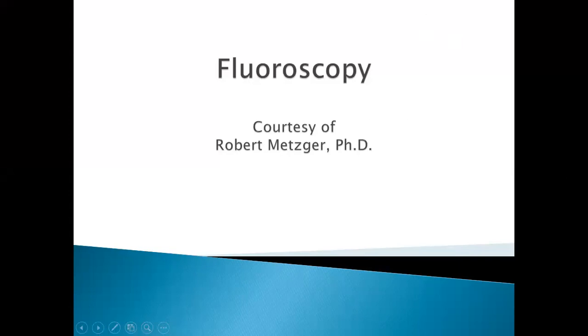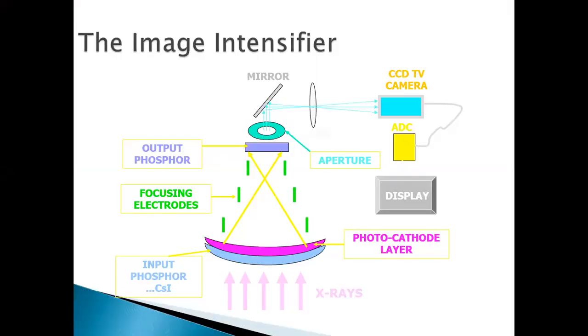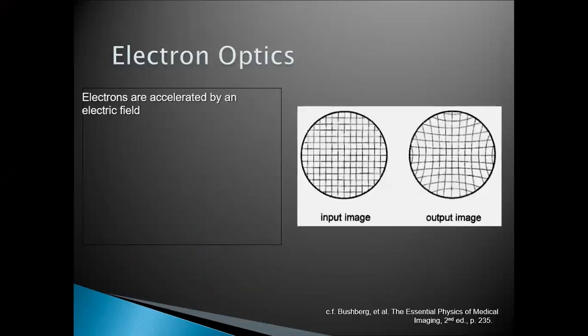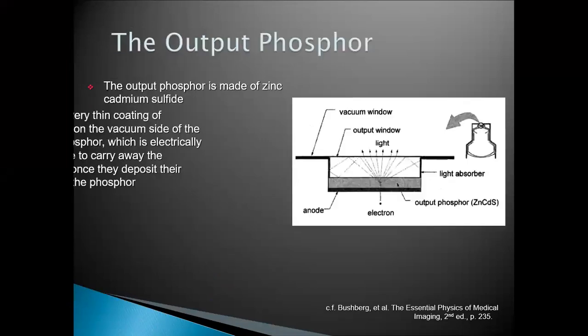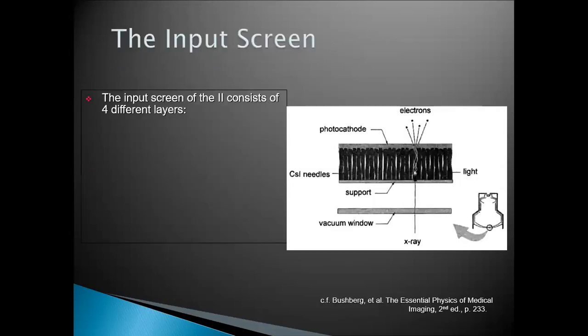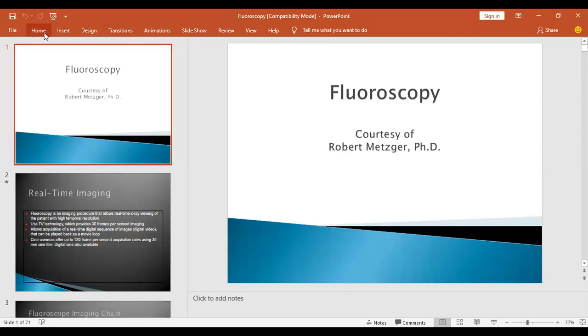We saw all of this last week. The image intensifier, the most important part of the fluoroscopy machine, of course, is gradually being replaced today by a flat panel. Let me just do a brief survey of what we did last week.